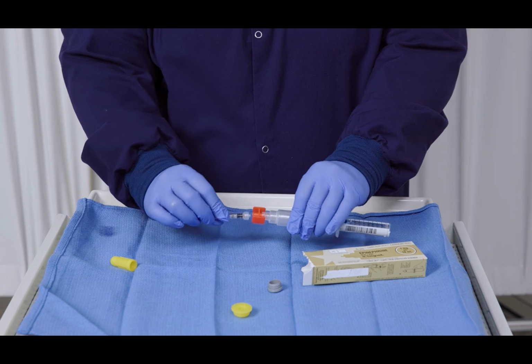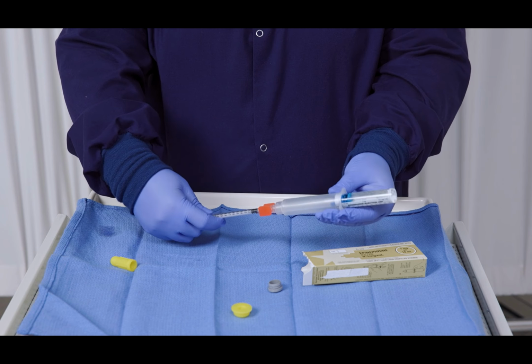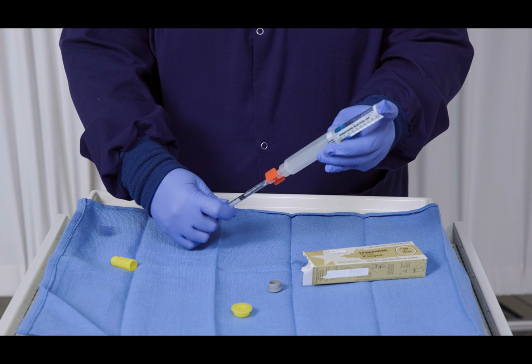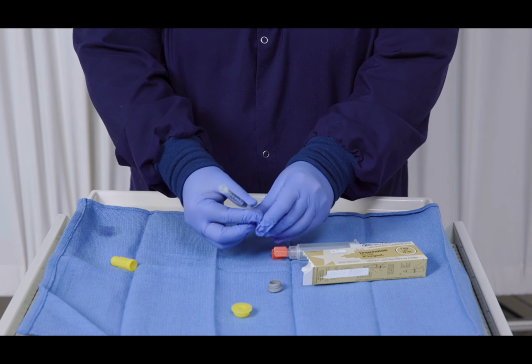Remove the syringe now filled with epinephrine from the stopcock or connector. Ensure that there are no bubbles in the syringe. Ensure that you have the correct amount of epinephrine in the syringe, which is 0.6 mLs for this example.